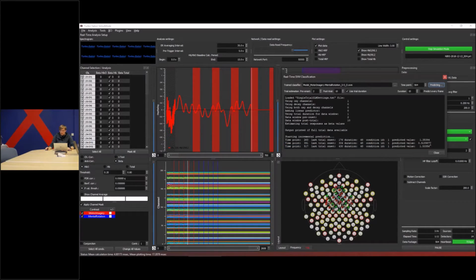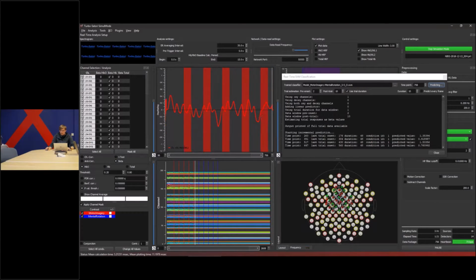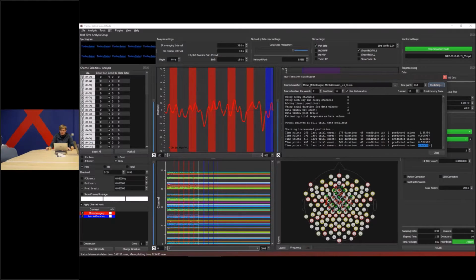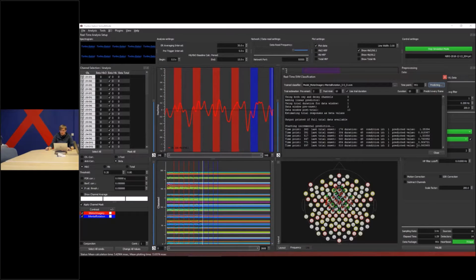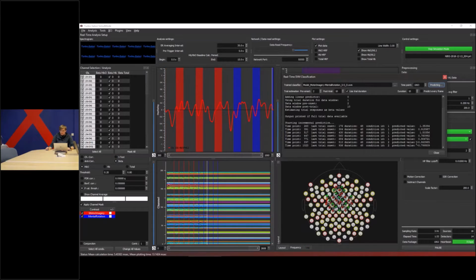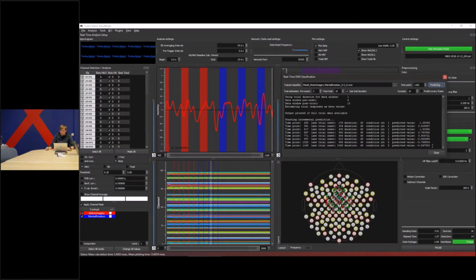Also see a positive value, also meaning it's the first condition. Okay. And again, another motor imagery, let's see if it's classified again. Yes, this was again correct. Now it starts the second condition, mental rotation, and we now see, okay, now we get a negative value, meaning that it's the condition 2. In the second trial again, negative values.